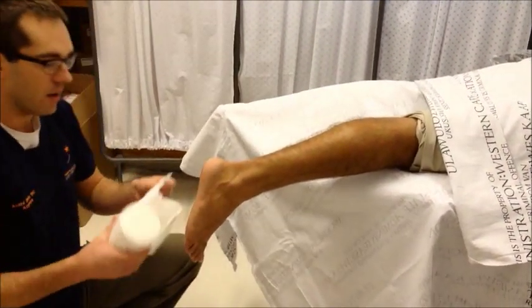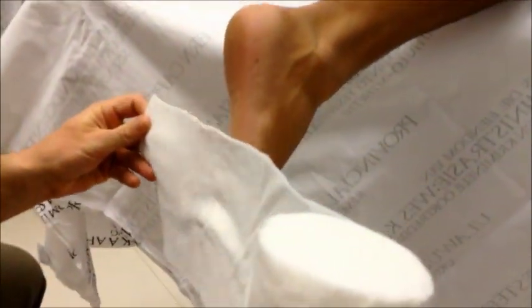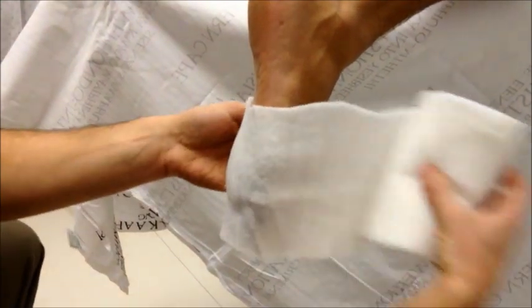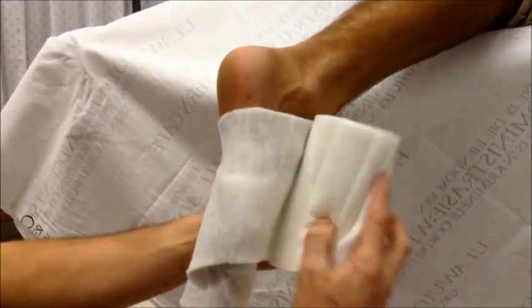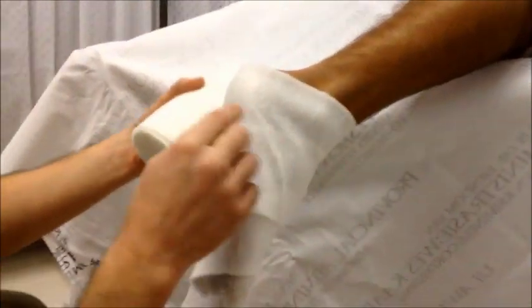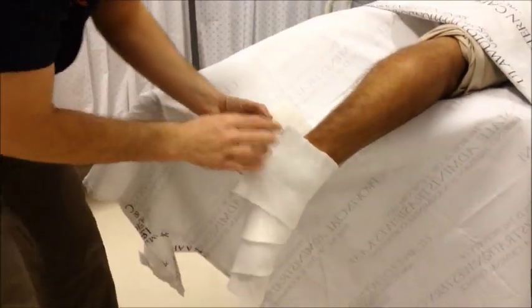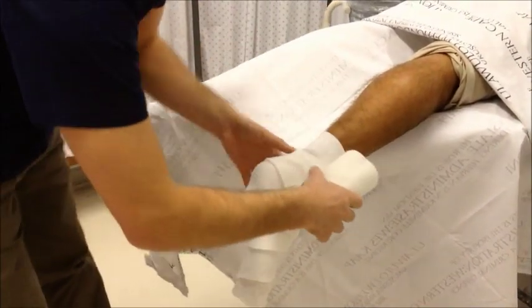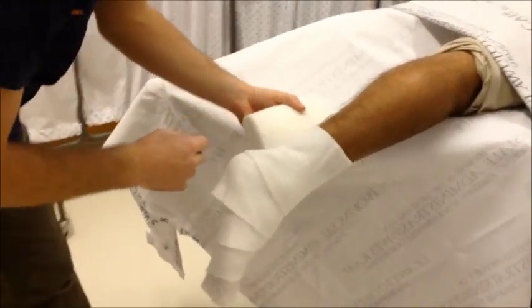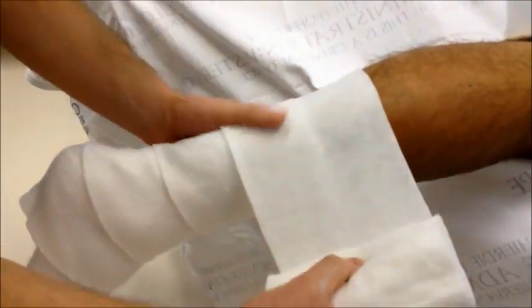I like to start wrapping at the feet and we make sure that the skin wool goes beyond where we want the plaster to end. Start around there and we're going to be doing a 50% overlap. Make sure that when you're going around the heel here that you are well covered on the heel. If you have a little dog's ear like that, you can just tuck it in neatly. You'll see what I mean by a 50% overlap — that is just that we make sure 50% of the layers are overlapping, which means you have a real two layer cover on every part of the leg.